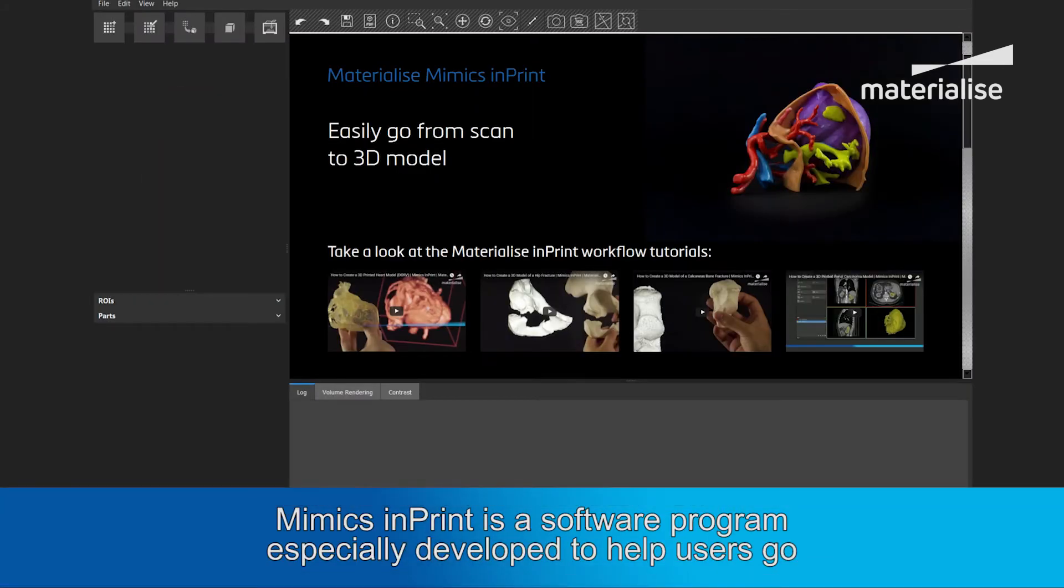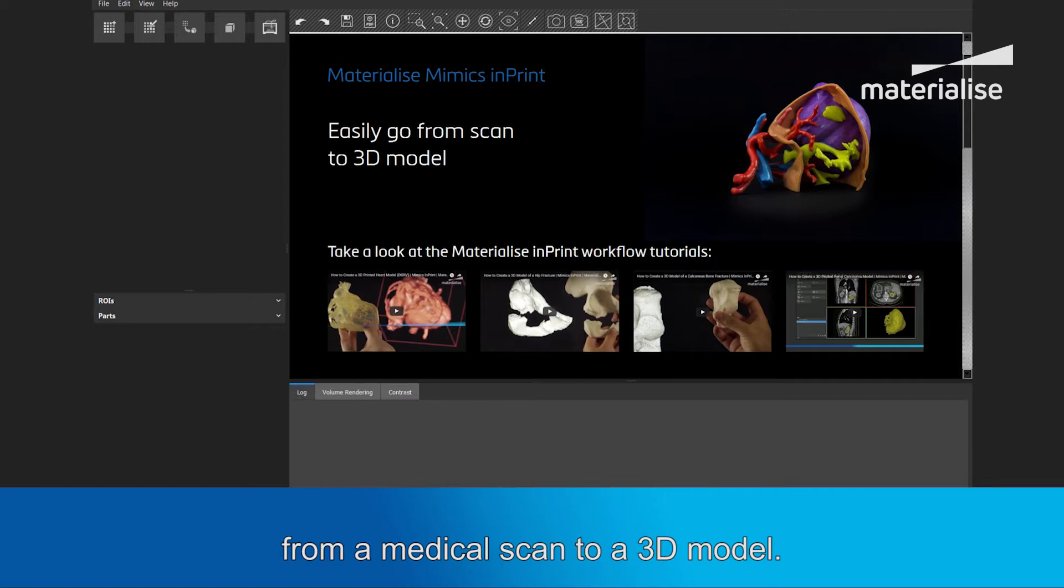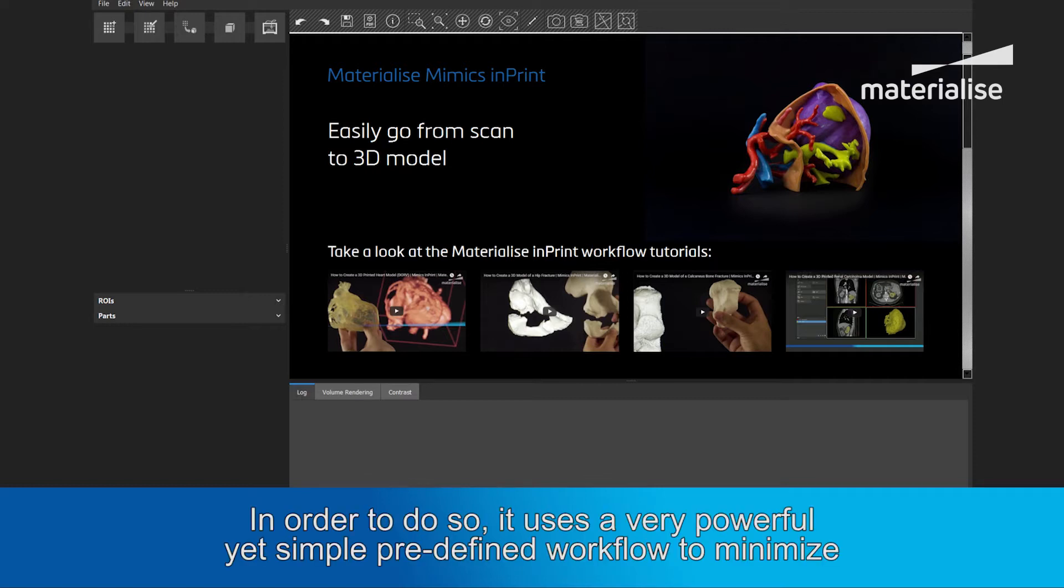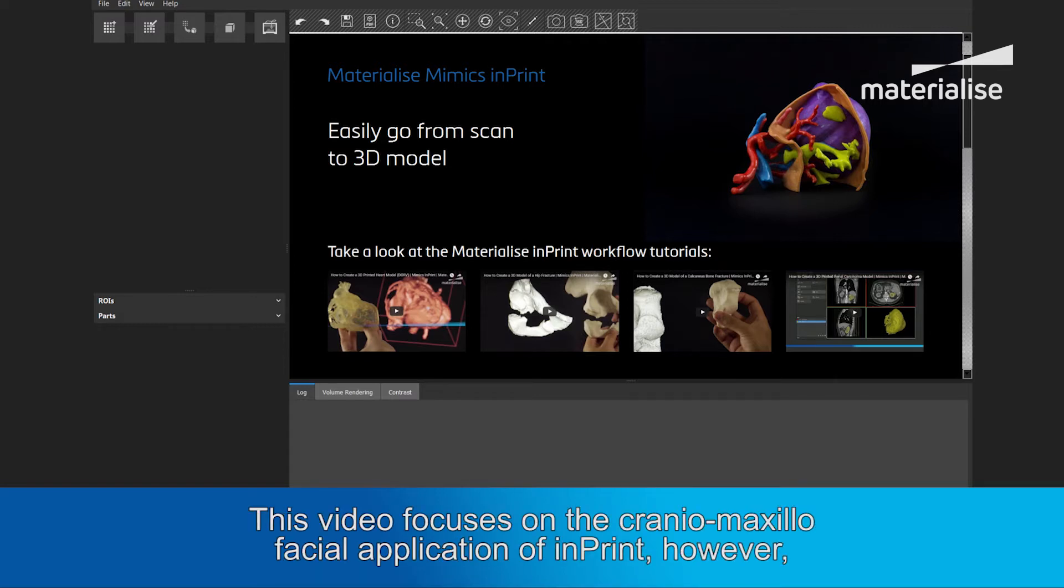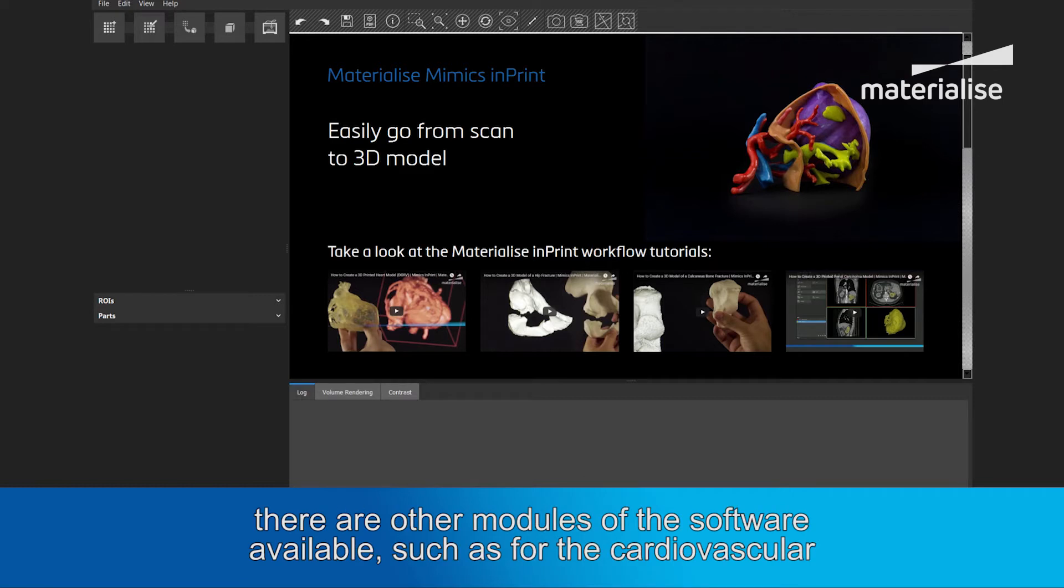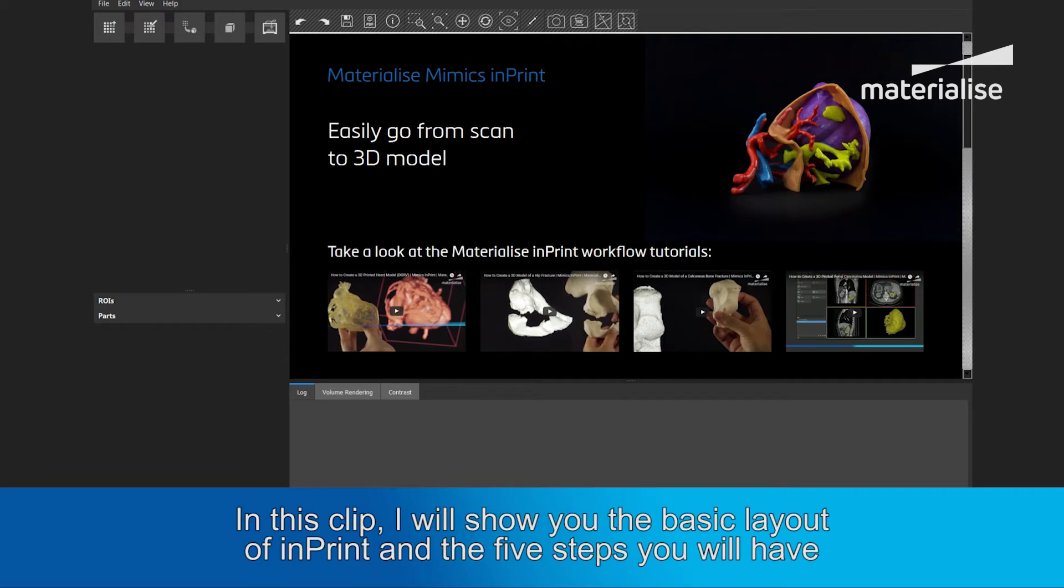Mimix Imprint is a software program especially developed to help users go from a medical scan to a 3D model. In order to do so, it uses a very powerful yet simple predefined workflow to minimize time and optimize user-friendliness. This video focuses on the cranio-maxilio-facial applications of Imprint. However, there are other modules of the software available, such as for the cardiovascular and orthopedic fields.